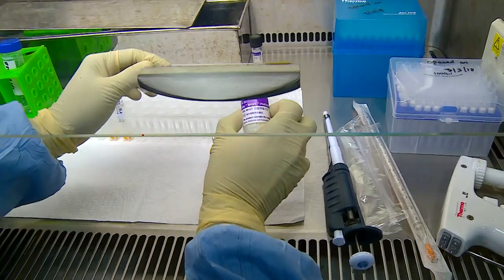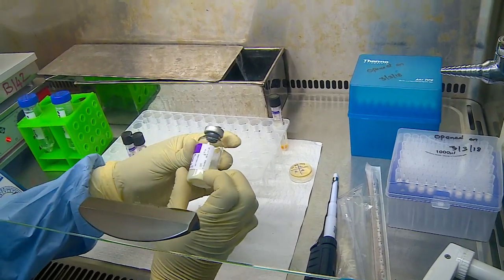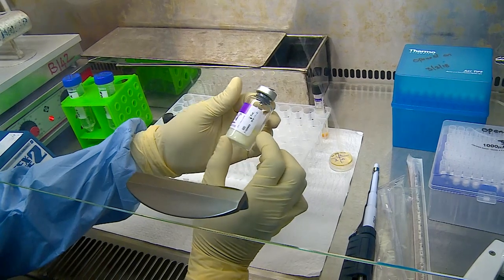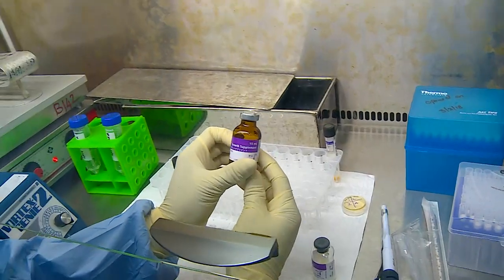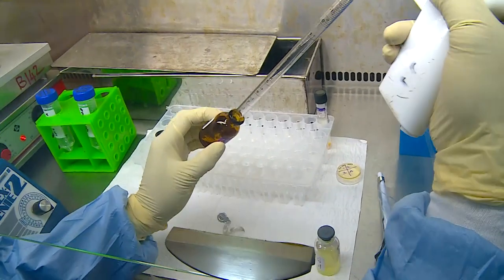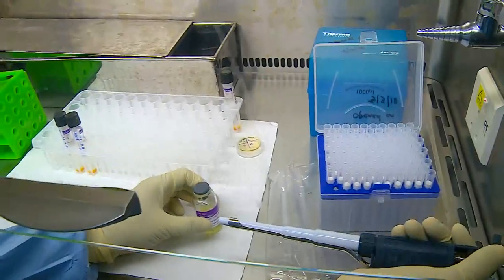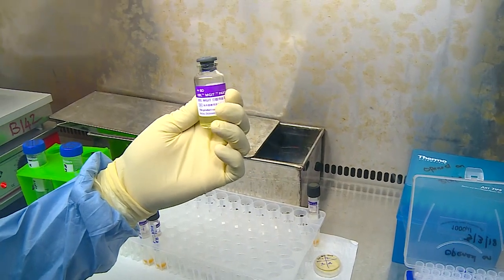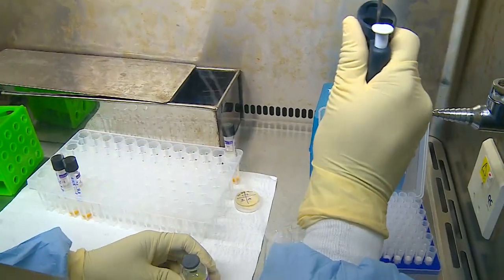This vial contains PANTA in a lyophilized powder form, along with a lot number and expiry date. This is reconstituted with 15 ml of the growth supplement that is provided along with the kit. After addition of the growth supplement, the reconstituted PANTA is ready, and 0.8 ml of this is added to the MGIT tubes.